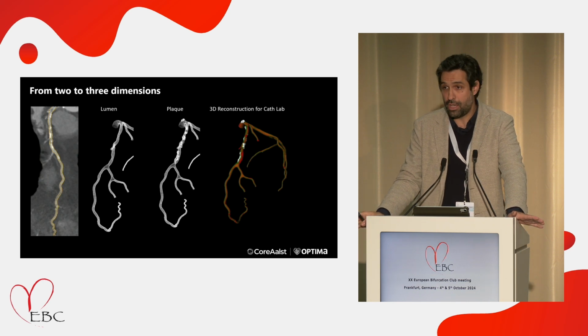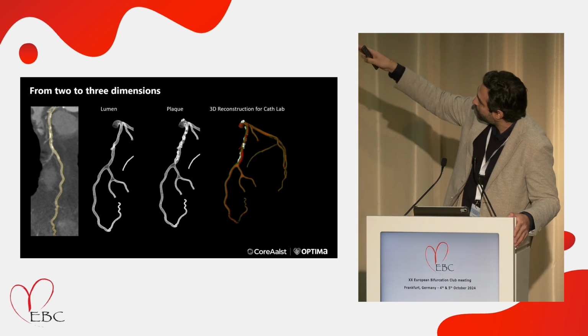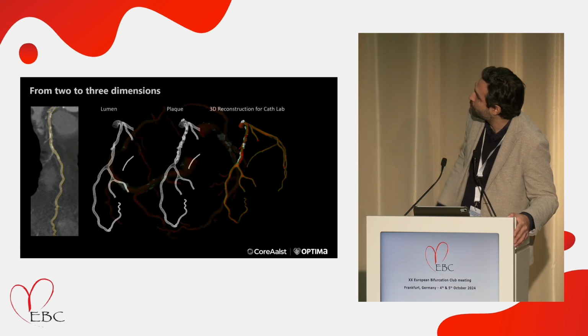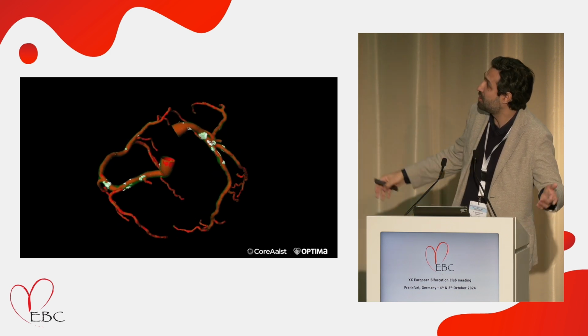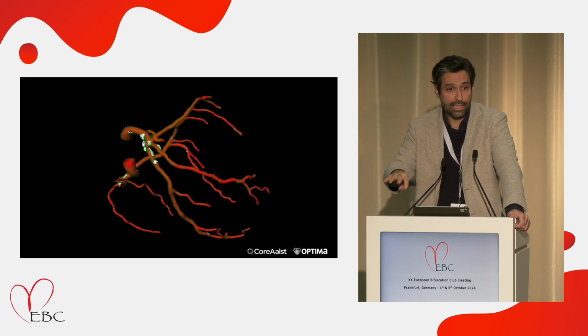This is the same case, 3D mesh reconstructed, and now you see that the calcium becomes white and the non-calcified plaques become green. If you want to look at this case, this is what you have. And this is going to be in front of you in the cath lab. We're going to show you what we're doing.